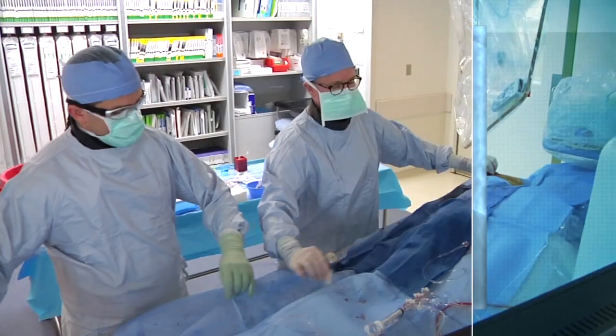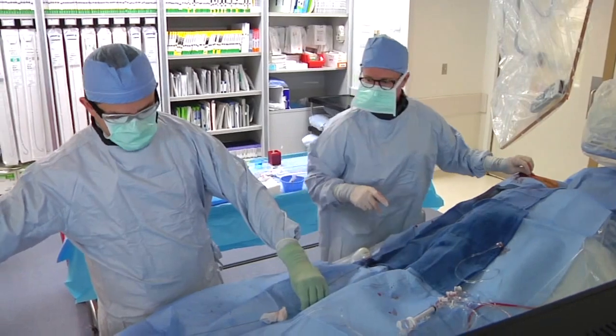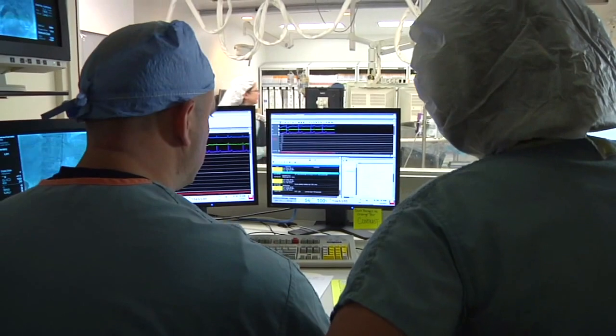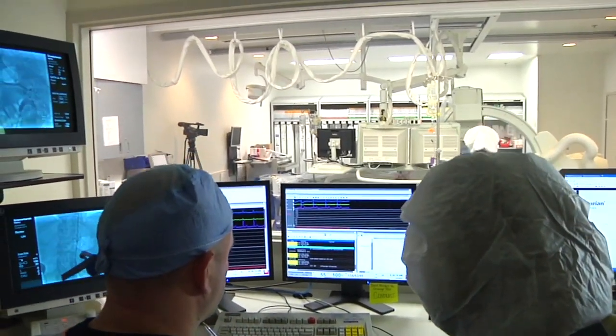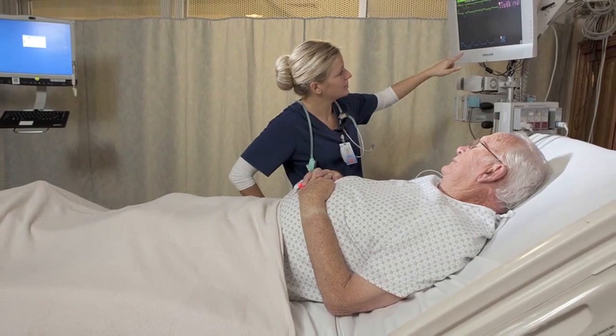Once the procedure is complete, the catheter and sheath are removed from the radial artery and a transradial or TR band is placed on the wrist, which is typically worn for two hours, providing pressure to prevent bleeding. The patient is allowed to sit up immediately after the procedure.